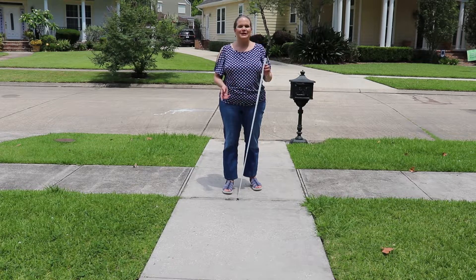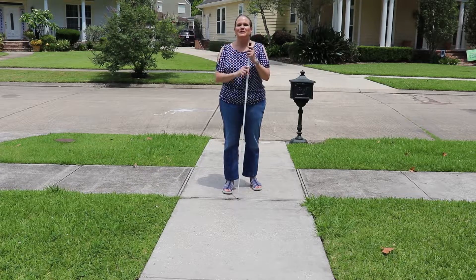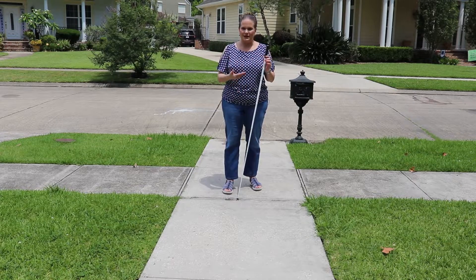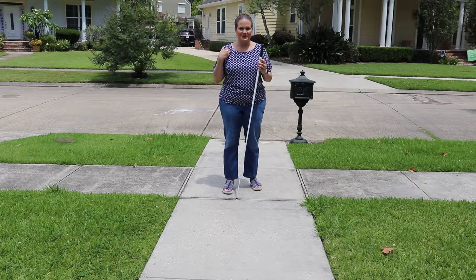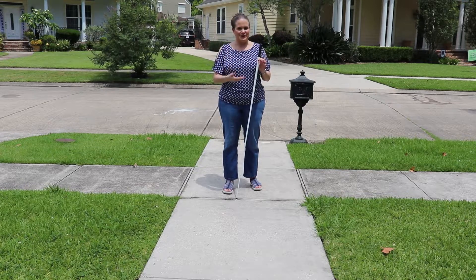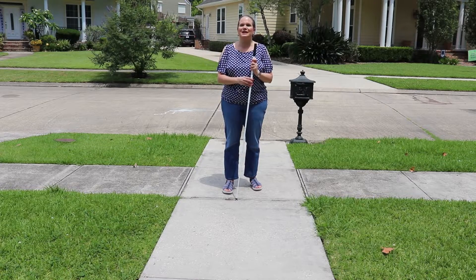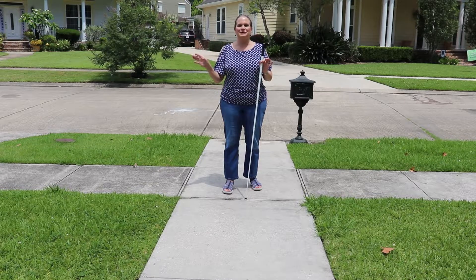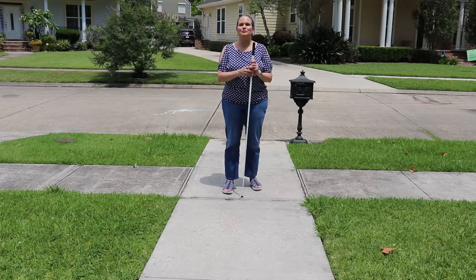It's important to know that the cane can be a helpful tool to keep you safe, but if you don't know how to use it properly, it can actually be dangerous to yourself and others. There are professionals that spend years of specialized study to learn how to assess and teach people how to use the white cane. They're called Orientation and Mobility Specialists, or O&M Specialists. I am not an Orientation and Mobility Specialist — I'm an Occupational Therapist. But I have been trained on how to use the cane and I use it every day. Therapists like OTs and PTs do not have the credentials to teach people with low vision or no vision how to use the long white cane safely. That is strictly the realm of the Orientation and Mobility Specialists. If you're not sure where to find one, reach out to your state agency for blind services or your local VA for a resource.